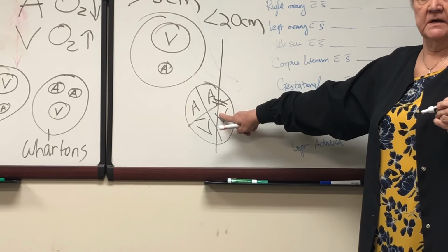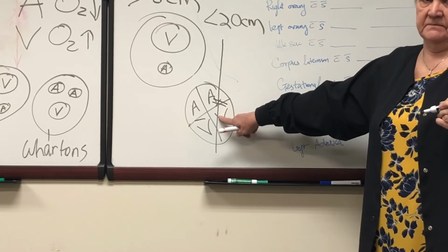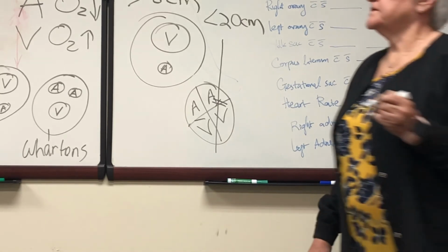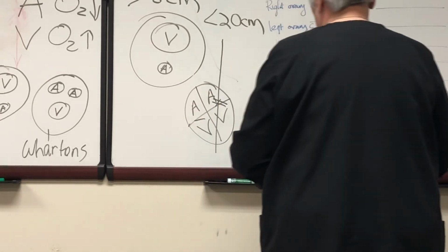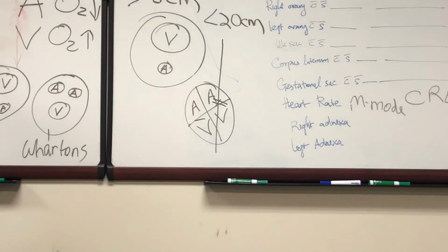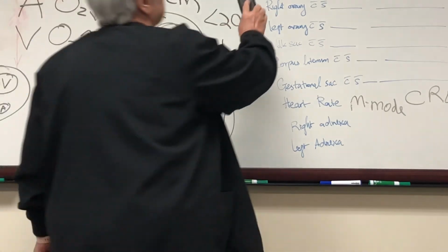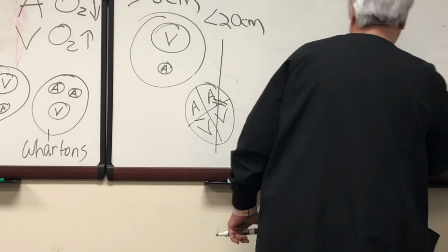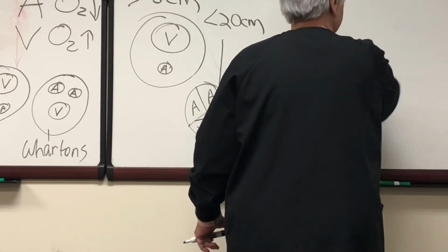Your sample volume on that leaflet. There's some more things. Let's talk about the heart. So that's the location you get the measurement of the heart? Heart rate, yeah, at the 4-chamber heart. Good job, Dewey.